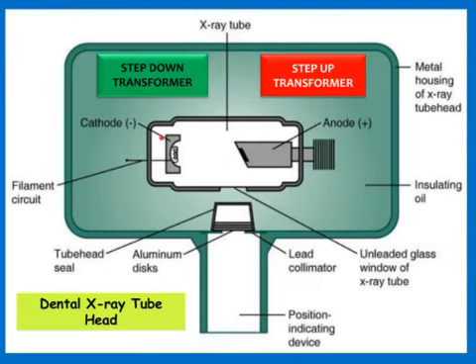Okay. Now the negatively charged cathode with the filament and the cup. What happens here? The normal line voltage is 110 or 220, and it is supplied to the filament. Now there is a problem, as we discussed in the lab, that we do not want this much voltage. We want only 3 to 5 volts or a maximum of 10 volts.